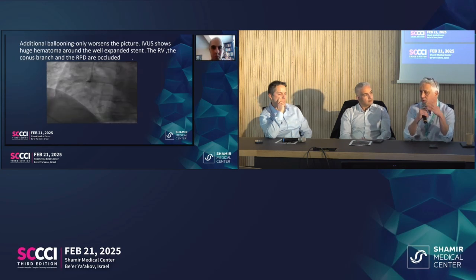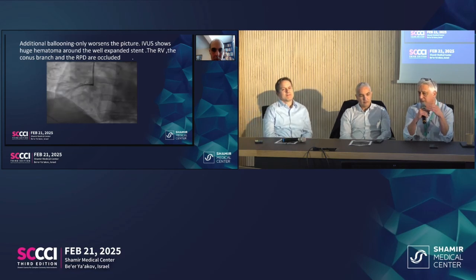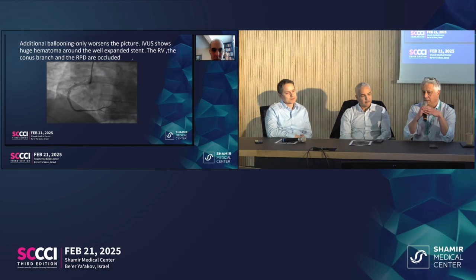It's not a matter of how it looks at the end of the procedure, it's a matter of how it works at the end of the procedure. When you have multiple side branches, end branches, and good flow, even if the artery is dissected, it is better for me in the CTO scenario to leave it dissected and to heal with the help of DCB.